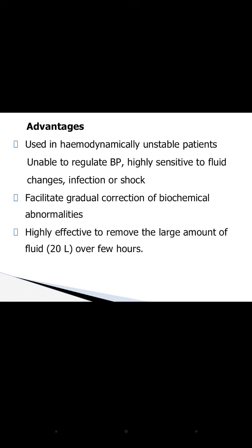It also facilitates gradual correction of the biochemical abnormalities. So there will be gradual correction of the electrolyte imbalances. It is highly effective to remove a large amount of fluid over a few hours. So basically 20 liters of fluid is approximately removed over a few hours.